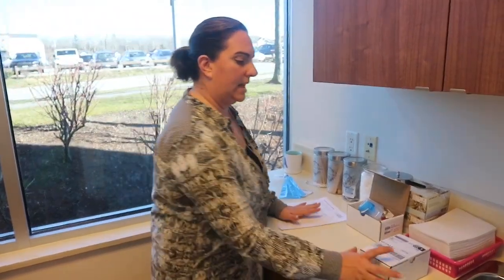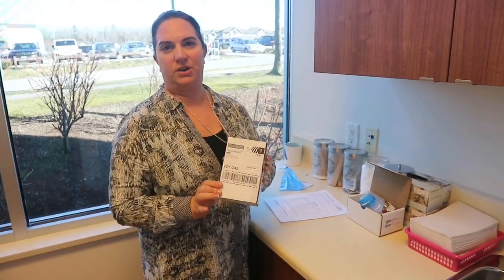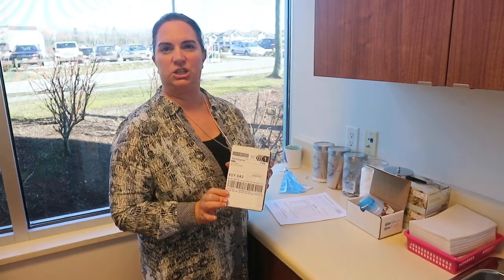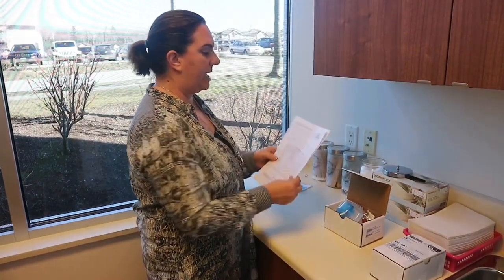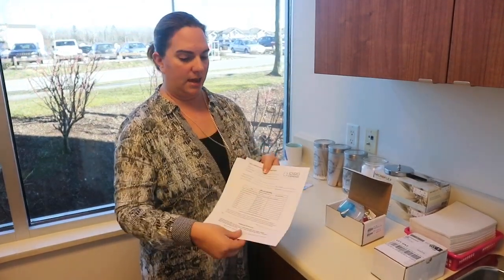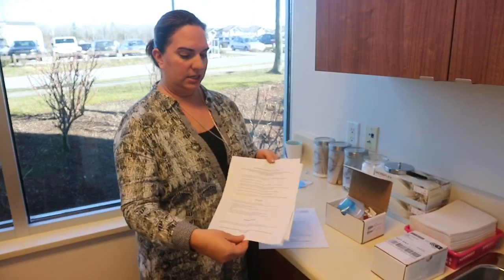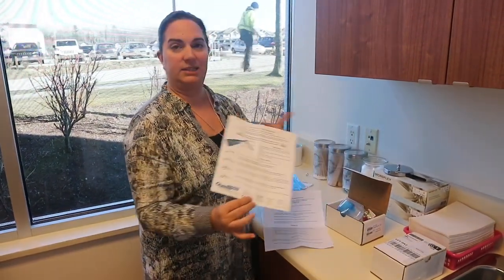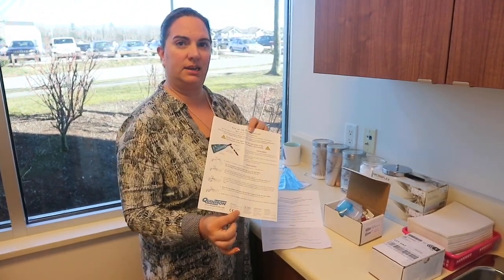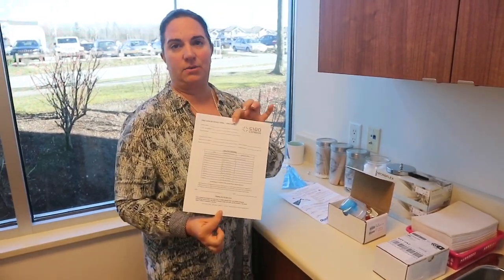When you get your SIBO kit, make sure that there is a return label on the outside of your kit. This makes it really easy to ship back to us. Within your kit you should have three pages: one is an intake form with your timetable, the second one is your preparation diet, and the third one is how to collect breath test samples. All three of those should be in the test kit that you get. The only one that you actually need to ship back to us is the requisition form.